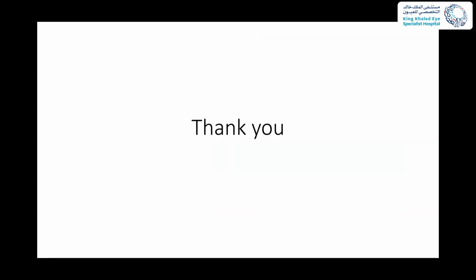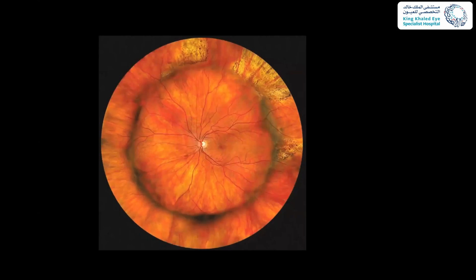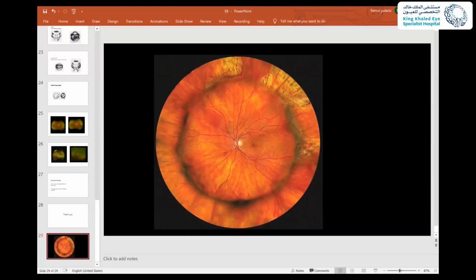Thank you, Ramzi. Thank you for that nice presentation. Now, it's very clear, and as you mentioned in the summary, that scleral buckling is an old technique, actually. But if the patients are selected properly, then we can enjoy very high success rates. But I also think that scleral buckling lately has benefited from all the other advances that vitreoretinal surgery has to offer.